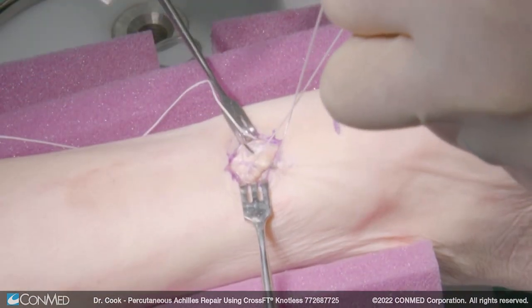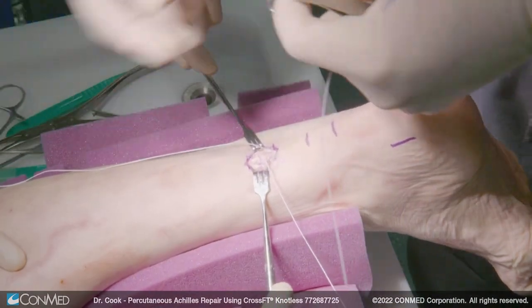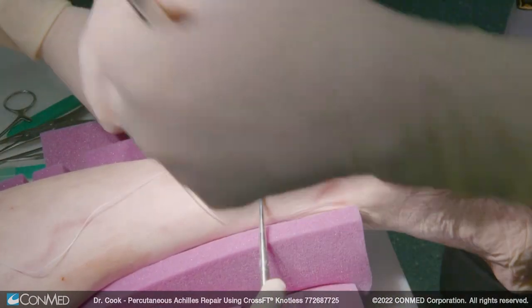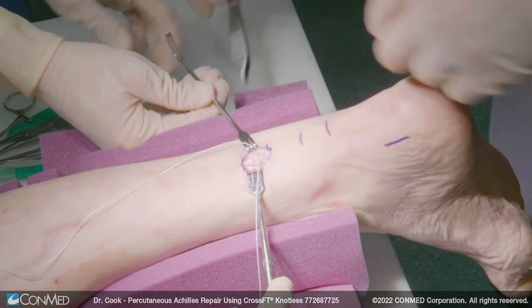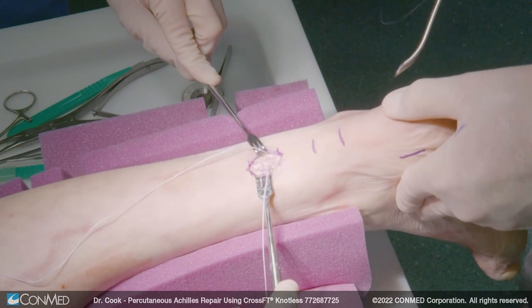Now we have three on each side and your construct is incredibly strong. So now we want to tunnel this down to the calcaneal insertion point. We're going to create our incision and we can probably go ahead and suture.